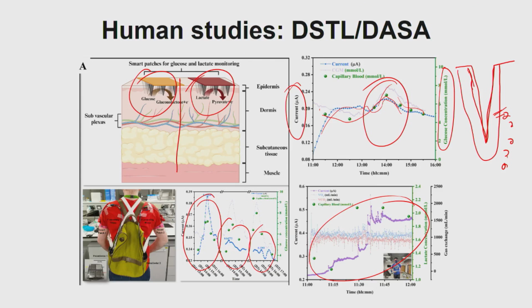Right? That factory calibration actually goes through all the enzymatic degradation process. It looks into the lot number. So all of these devices have got a lot number, they've got the day when they were all manufactured, expiry date and things like that. So you can get from that the batch of the enzyme that was used and things like that.